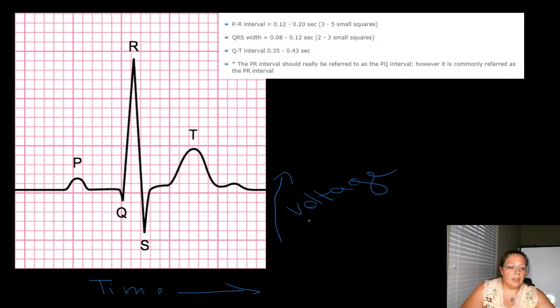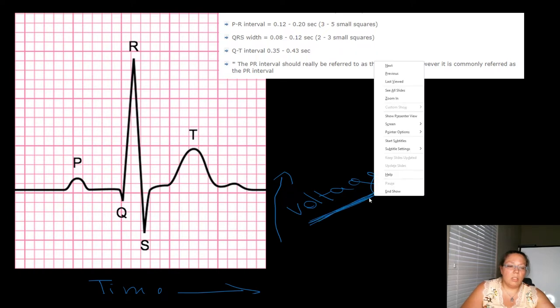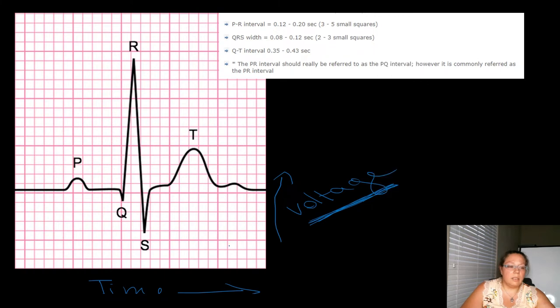I don't worry so much about voltage in my career. We'll touch on it a little bit when we talk about 12 leads. But the thing that is really important for you to read up on and think about is the time portion. As nurses, we measure out these different intervals and we can figure out whether there's a delay in response, which means there's stretching of the muscle or some sort of dysfunction, a block, or ischemia to the heart, whichever might be causing the delay.